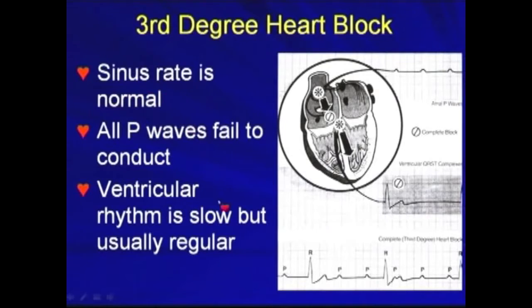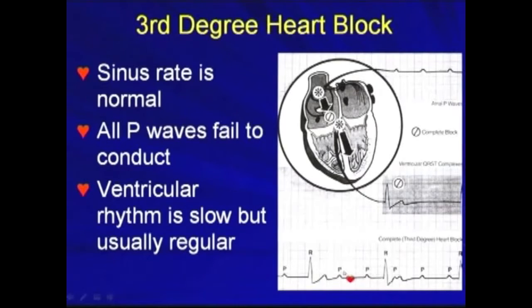The sinus rhythm is normal here, but all P waves fail to conduct. The ventricular rhythm is slow but usually regular. So there's complete AV dissociation — there's no relation between the P wave and the QRS complex.